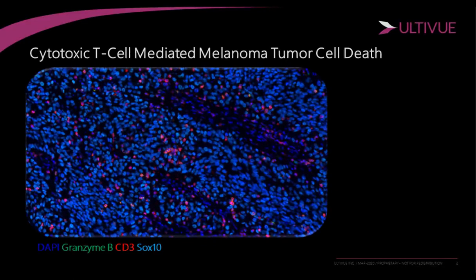Multiplex IHC is a tremendous tool to help address this specific type of problem. Multiplexing allows for a deep characterization of each unique tumor microenvironment while maintaining spatial context. The biological insights that can be pulled from this information is incredibly powerful. And on that note, I would like to highlight a very simple yet elegant example of this.